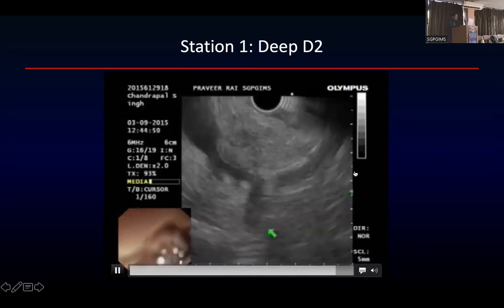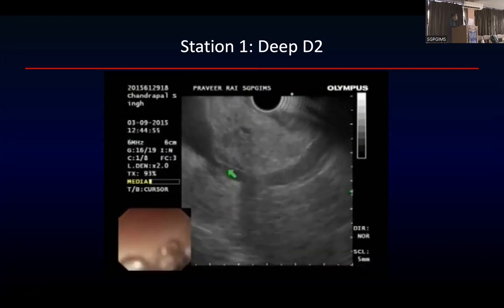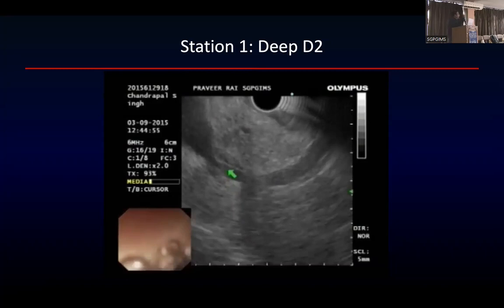और कुछ हो सकता है? Bile duct. Okay, I'll just show you further. So once you pull, then you will see aorta. The part you are seeing is uncinate. Beyond, if you just keep on pulling, you will see the pancreatic duct. You will see the CBD. Okay, CBD will be nearer to the probe. Further from the probe, there is a pancreatic duct.